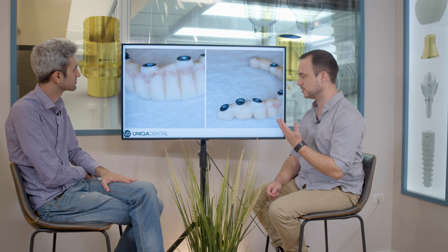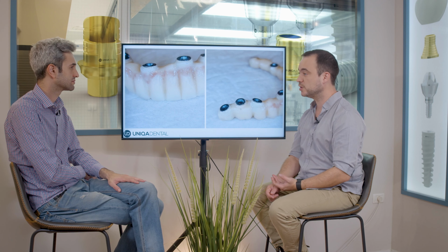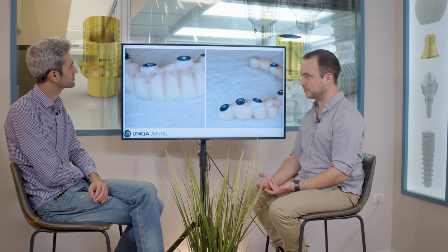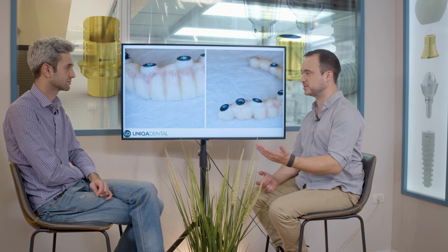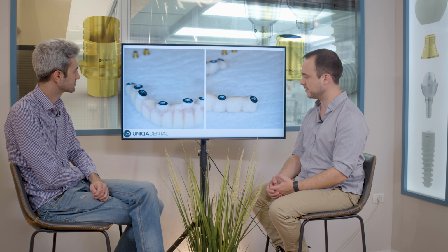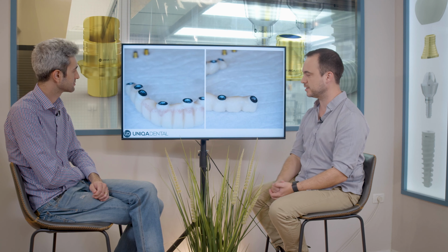You know that when you screw the zirconia bridge, you won't have any internal forces, because the cementation process was when the cement hadn't hardened. So the sleeves are perfectly passive. They compensated for those inaccuracies and those internal forces that could have been. That's all. You have a fine zirconia bridge with no gaps, nothing at all. Closed all the gaps with composite material.